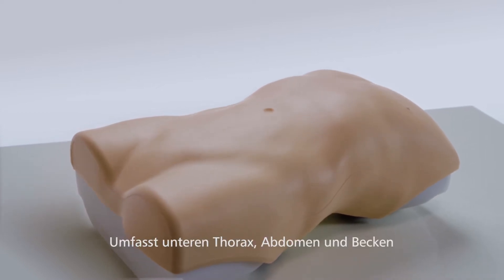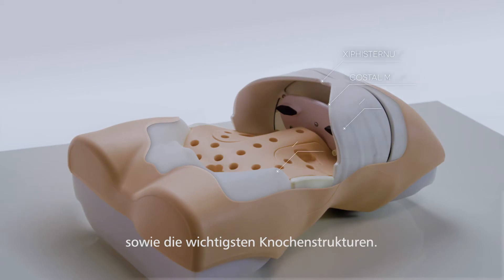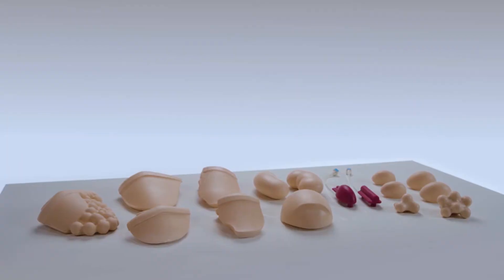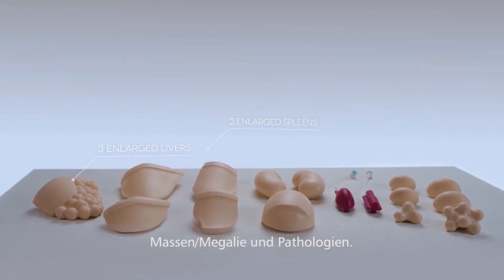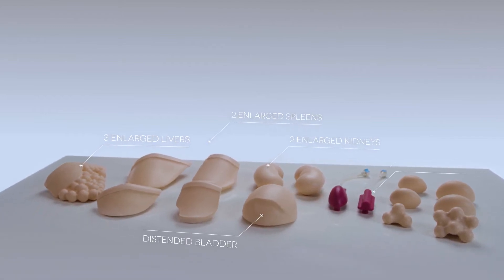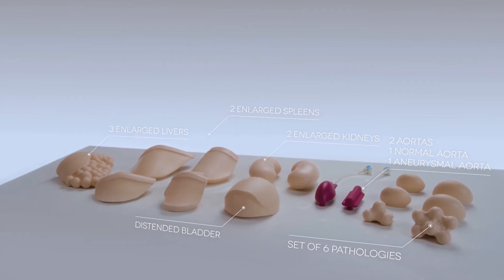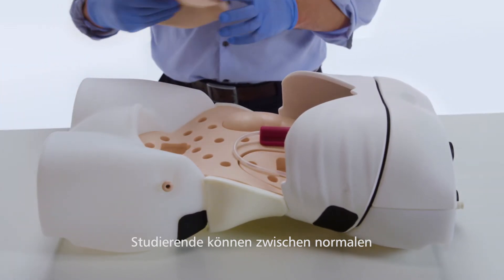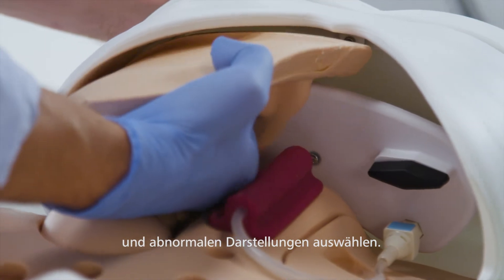The torso features a lower thorax, abdomen, pelvis and incorporates key bony landmarks. The training kit includes enlarged organs, varying sized masses and pathologies. These organs and masses can be quickly and easily inserted for students to differentiate between normal and abnormal presentations.